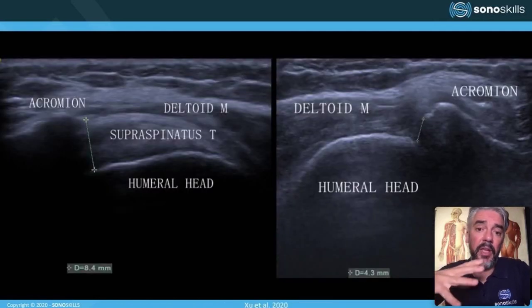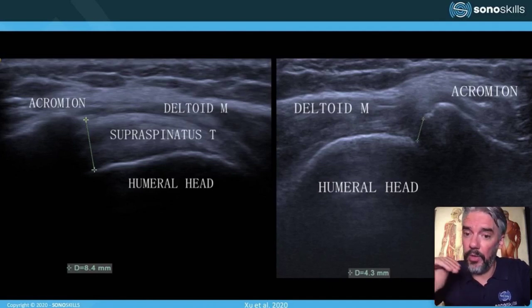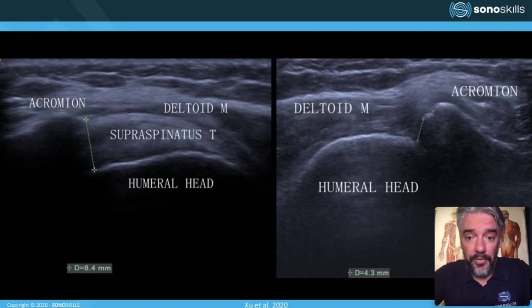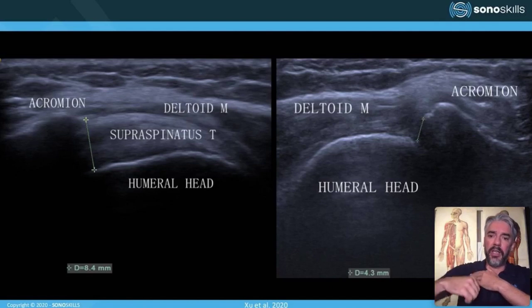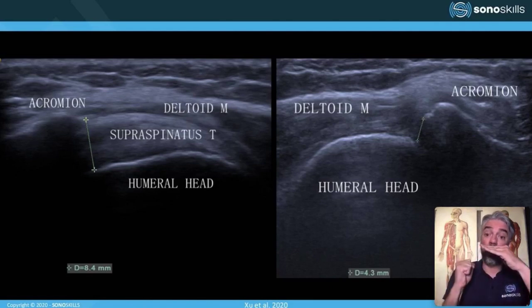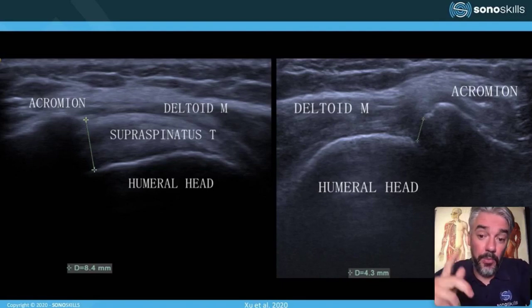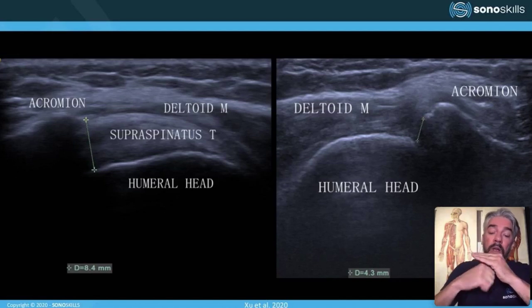And if a supraspinatus is fully torn and retracted, in many cases, in time, you also see a cranial migration of the humeral head. There is a loss of stability, so the acromiohumeral distance diminishes. Patients also complain about grinding because of this cranial migration of the humeral head. There is some friction between the caput humeri, the humeral head, and the acromion.